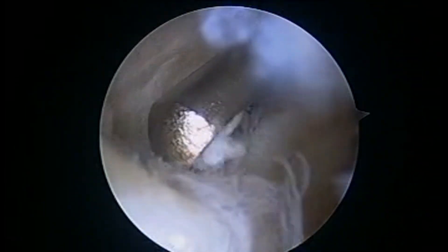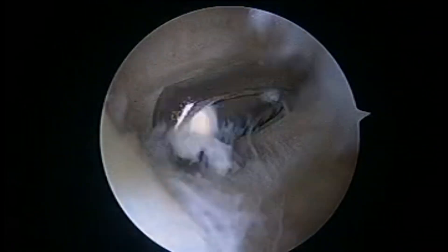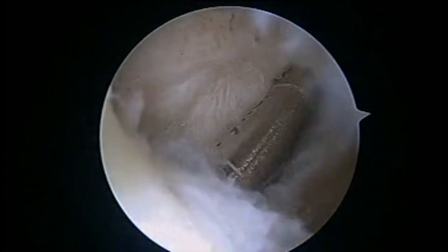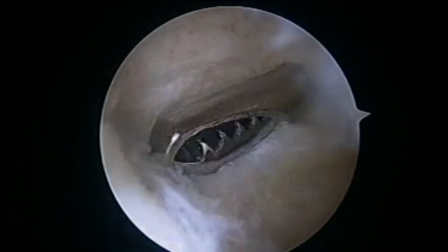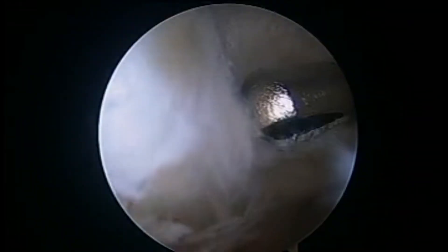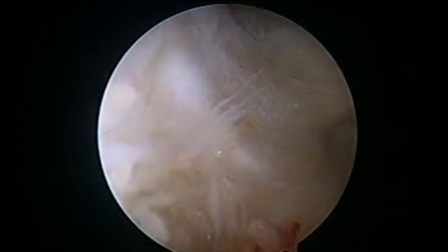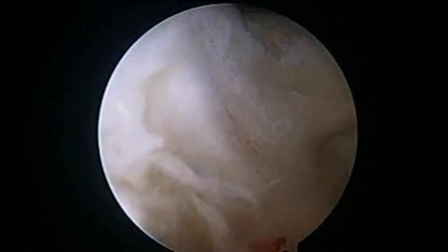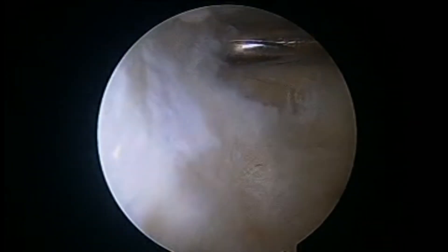We start debriding the posterior transverse synovial infold with the help of a shaver or a punch. The aim here is to create a rent in this transverse synovial infold, which is a one-way valve. When we create a hole and then express from behind, we see the contents of the popliteal cyst coming out through this rent.